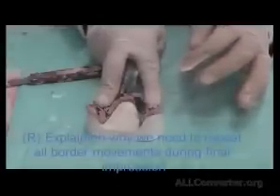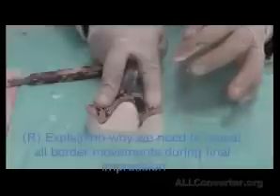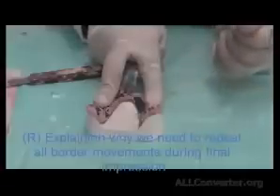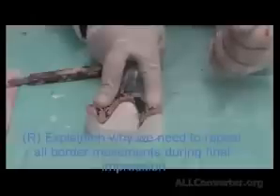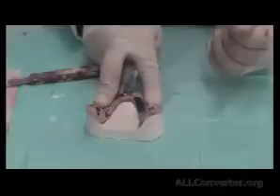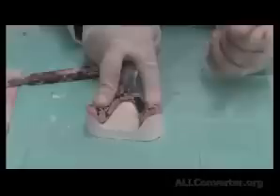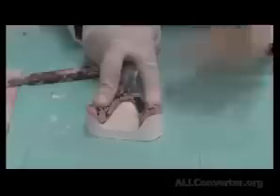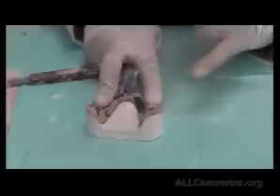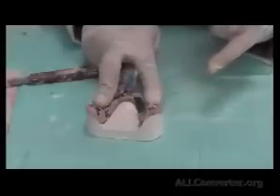Why repeat them in the impression? That's because once the patient goes back to rest, the sulcus depth goes back into its deepest location. This deepest location is not the one that will stay all the time while the patient is in function. What will happen is the denture might be overextended, and if the patient does a movement with his lips or cheeks, the denture will be taken out. So we make sure we record the functional depth, not the resting depth of the sulcus.